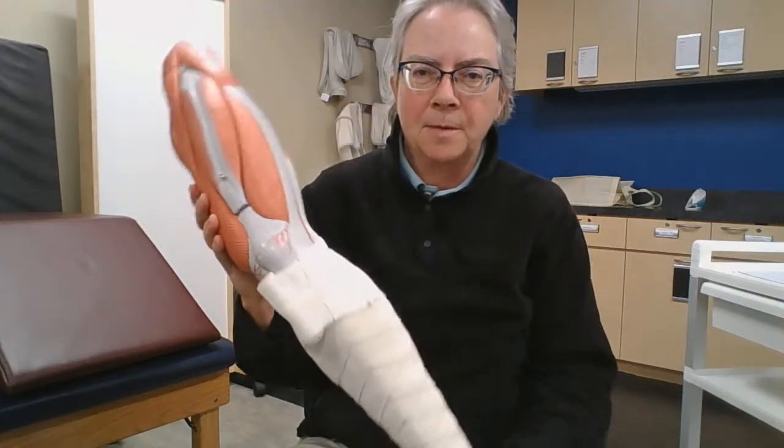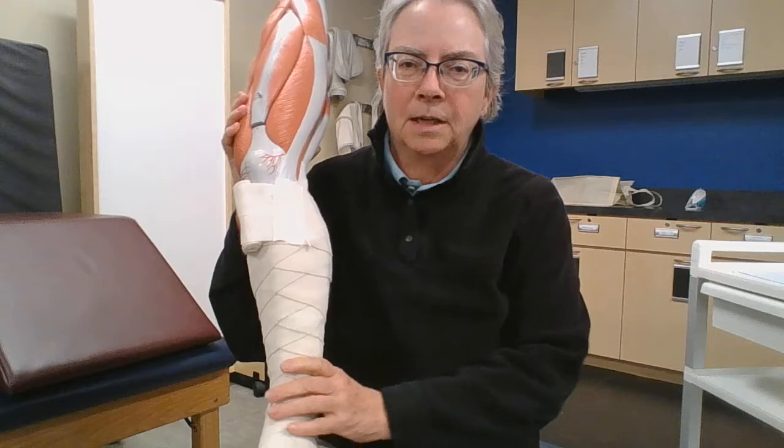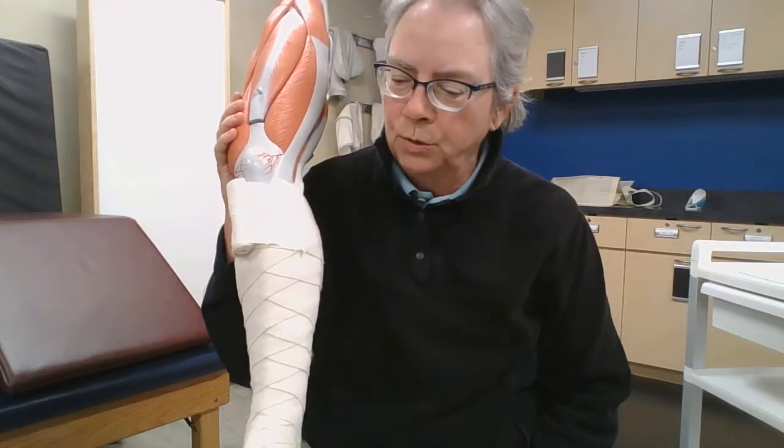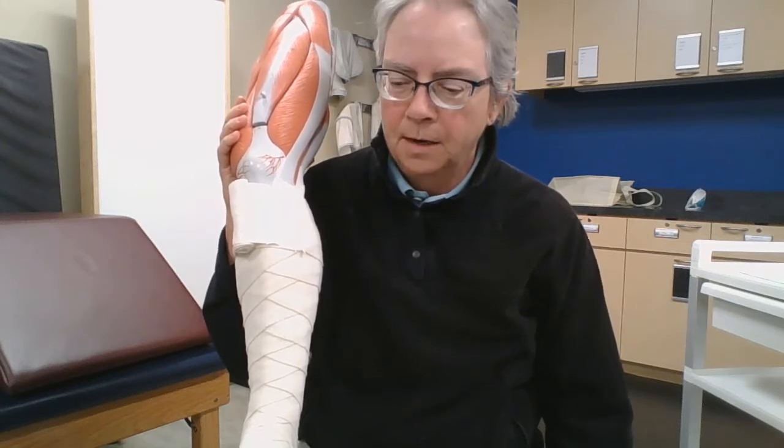You had the lecture on compression, and two of the things you're going to do for skill checks are one is ACE wrap one of your classmates for a sprained ankle. So I'm going to show you a few things here today before you have to do that. As you can see, I've taken, remember these from anatomy, the lower extremity here. I've taken one to show you how we do a really nice ACE wrap to work on compression for somebody who's had edema from an ankle sprain.